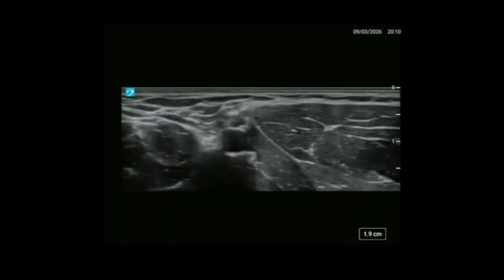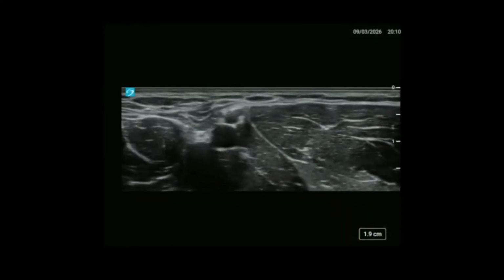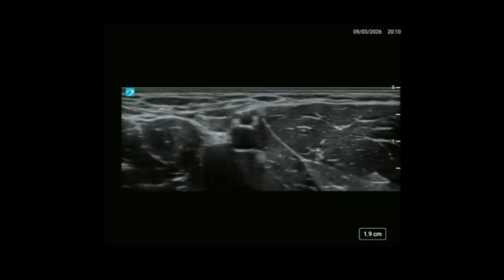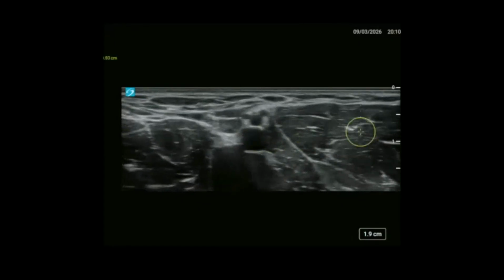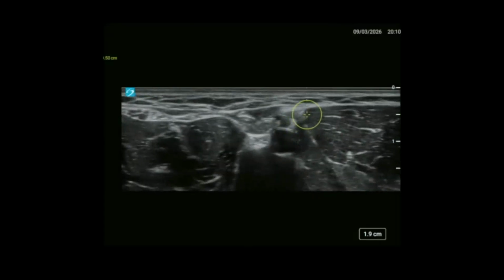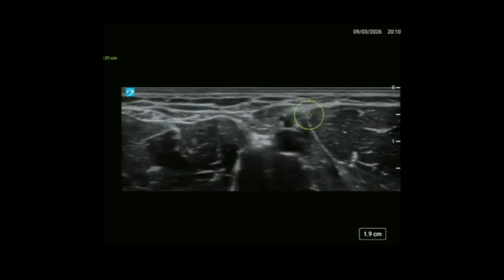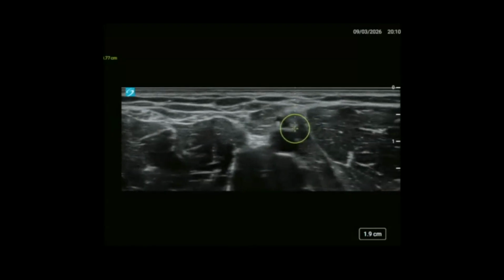So this is ideal because the artery is below, and I've got a bit of space, so I can come in from laterally, and I'd bring my needle in from over here. And again, I'm wanting to get around. I'll probably bring some local in over the top first, just to try and get into this fascial plane, and then hydrodissect round.